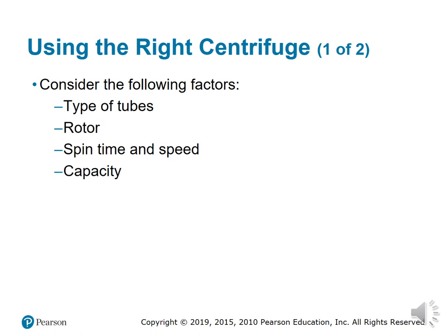Tubes like that go in a still big industrial-size centrifuge, but the containers that hold the tubes have a shorter capacity so that those tubes don't get lost in the container placed in the centrifuge, I'm sorry. So we have to make sure that we are putting the right tube in the correct centrifuge container.